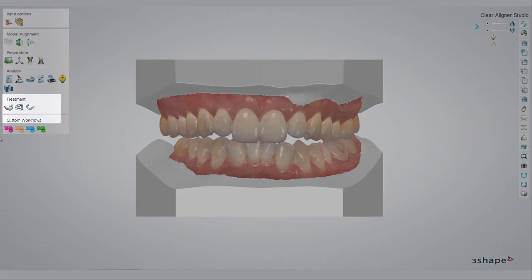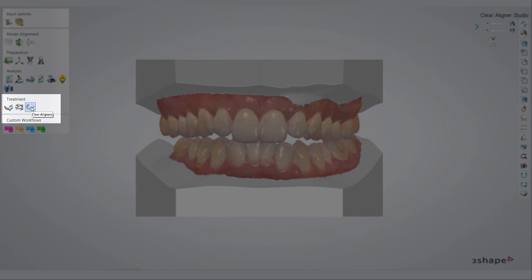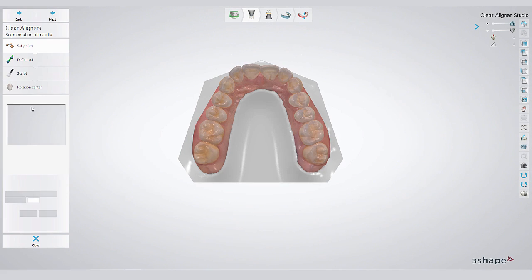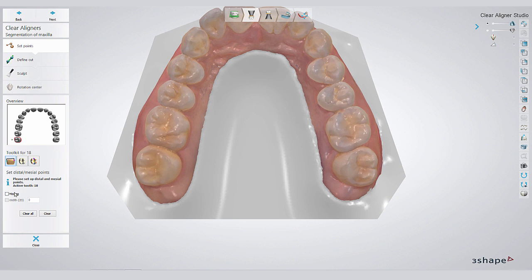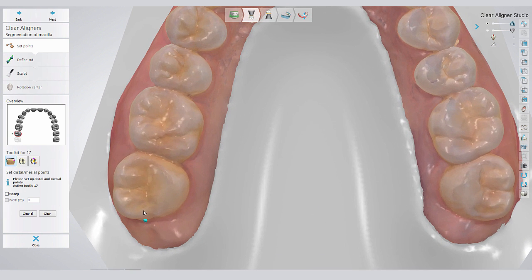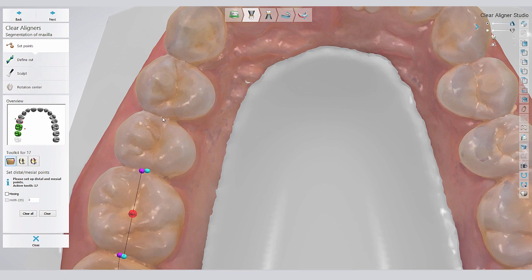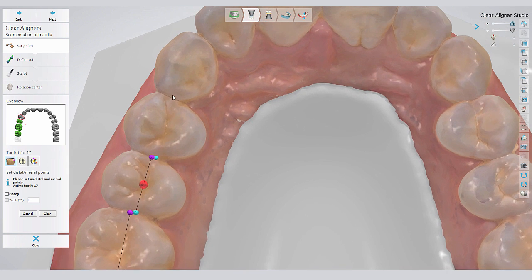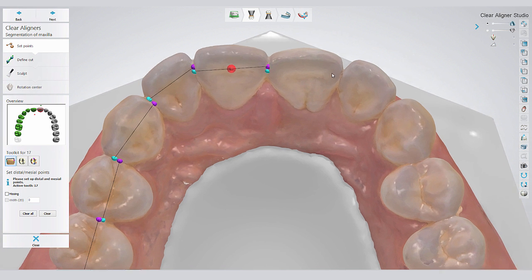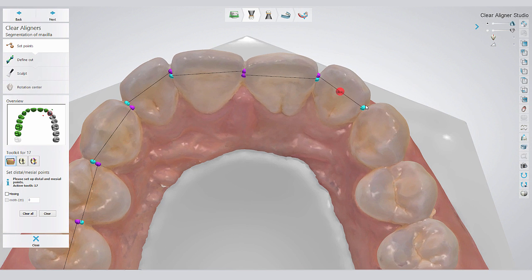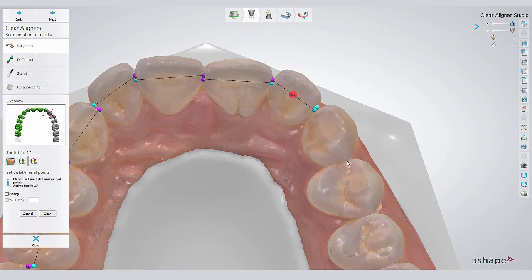We did all necessary preparation. Let's start the Clearliner workflow. This is a very intuitive workflow which will guide you through the segmentation of the teeth you wish to move. Selecting the distal and mesial end of each tooth enables the software to detect the marginal line and cut each tooth.